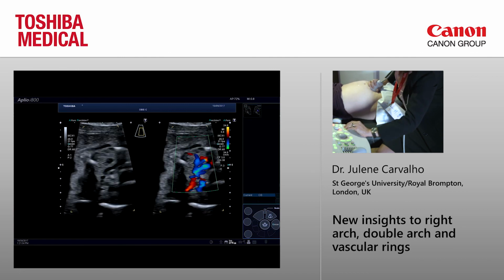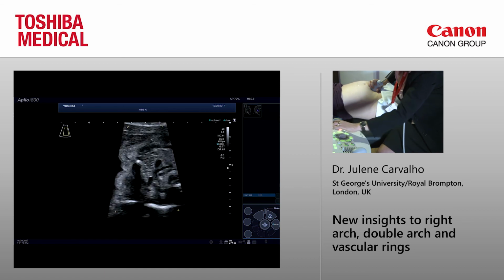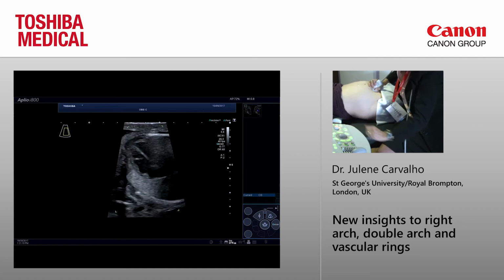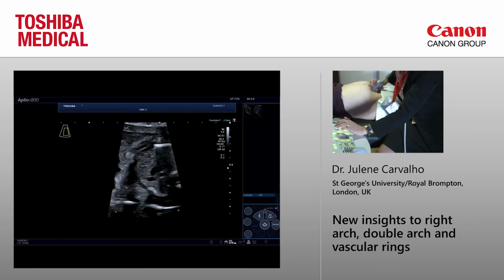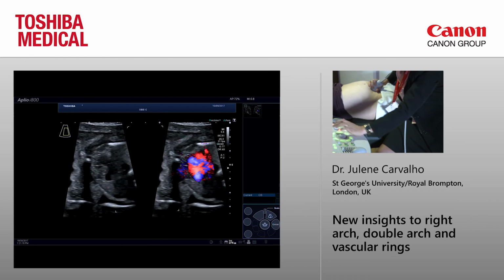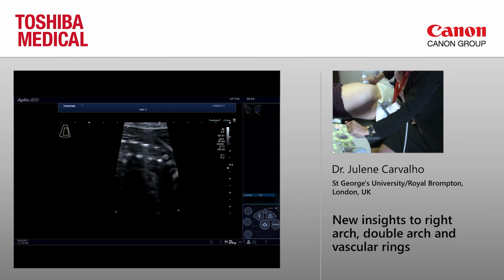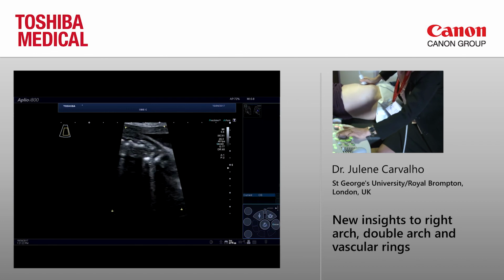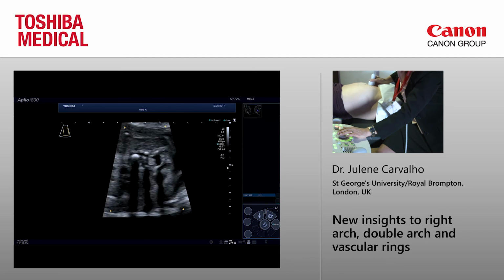Again, the same. So it's not too difficult to do. And the fetus is cooperative because I tried early on, it was spine up. So if you go to a sagittal view, you wouldn't be able to say the position of the aortic arch if it's right or left side.